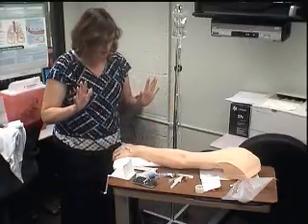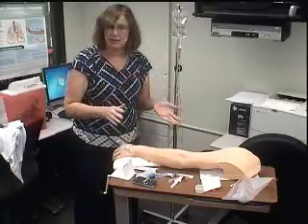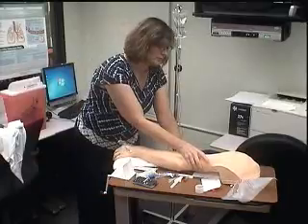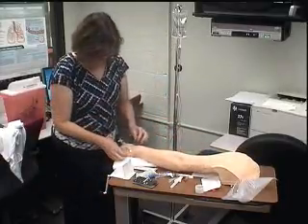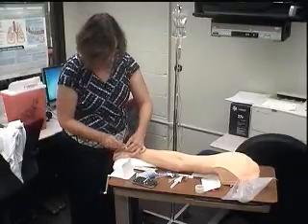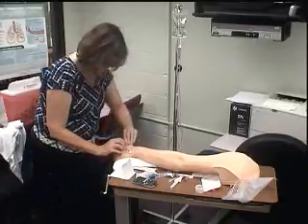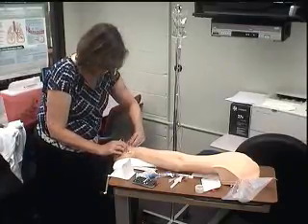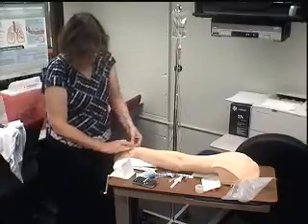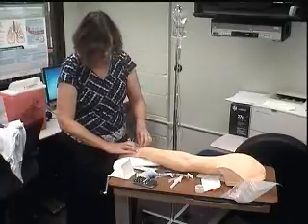So I've got my gloves on, pretend, right? I come in, identify my patient, name, date of birth, allergies, all that, right? And I'm prepared for removal. Now, I'm going to take my Tegaderm off, my tapered Tegaderm off. If you have a hard time taking this Tegaderm off, if you put a little alcohol inside on it, it'll kind of loosen. But I take it and I kind of pull and it kind of loosens itself too. So if I kind of pull and it kind of loosens, then I pull it all together.